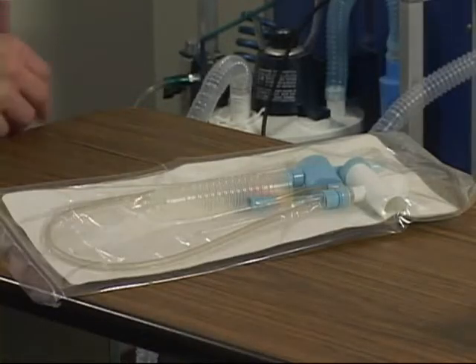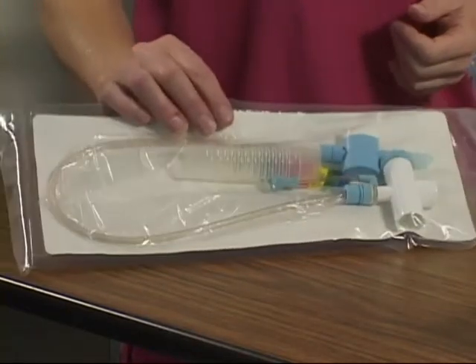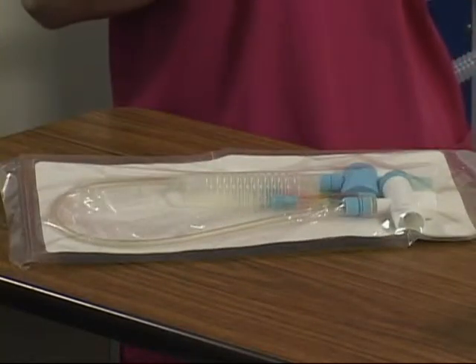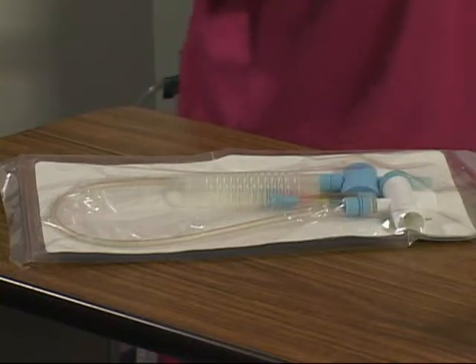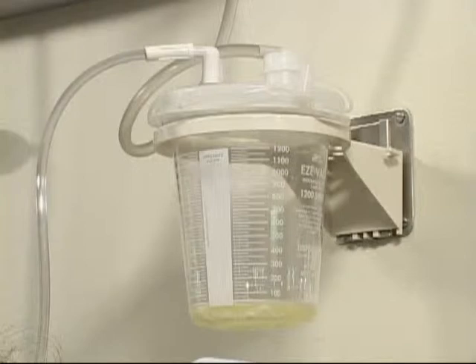The inline suction catheter is often packaged as a self-contained unit. It should be replaced if it becomes clogged or per the facility's replacement policy, often after 24 to 48 hours. The suction tubing connected to the canister is often changed when the canister is changed. This is when the canister is full or the secretions are thick or discolored.